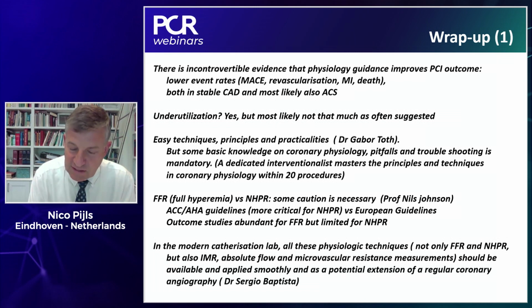But in many other cases, ambiguous lesions, let's say between 30 and 90%, note the number of 90 defined by Sergio, and multivessel disease, non-culprits in ACS, or post-PCI functional assessment, physiological evaluation is indispensable.